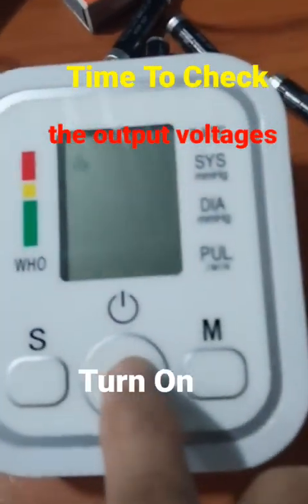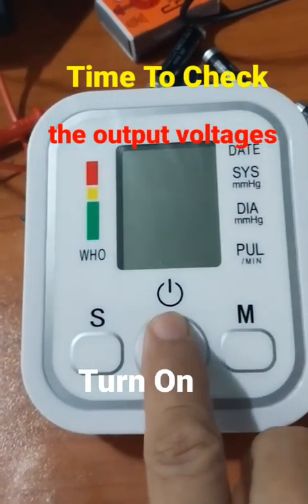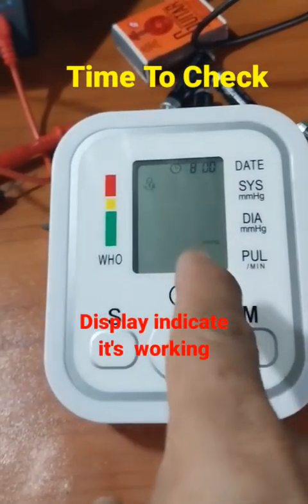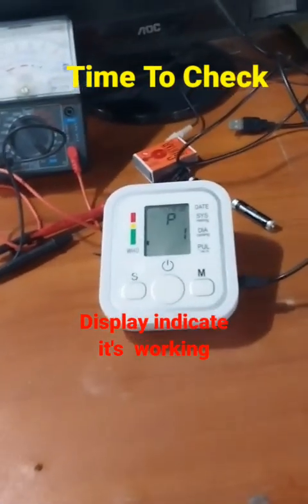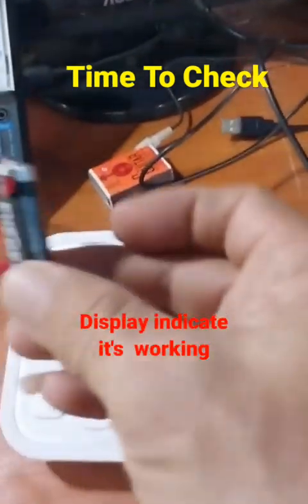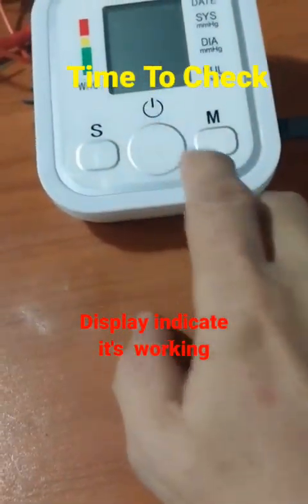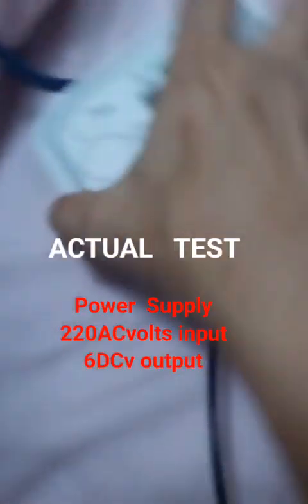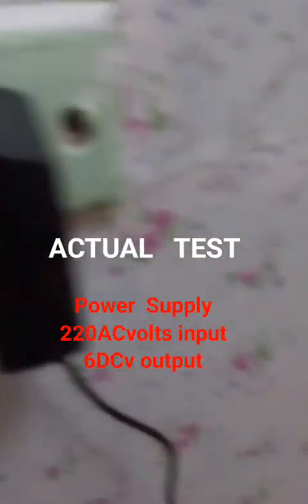You need to twist the wires from end to end until they are fixed, to avoid a loose connection. Then use electrical tape or a heat-shrink string to cover the wires. Now plug in the power supply from the 220V input, connected to the 6 volt output. Use a multimeter to test the voltage.